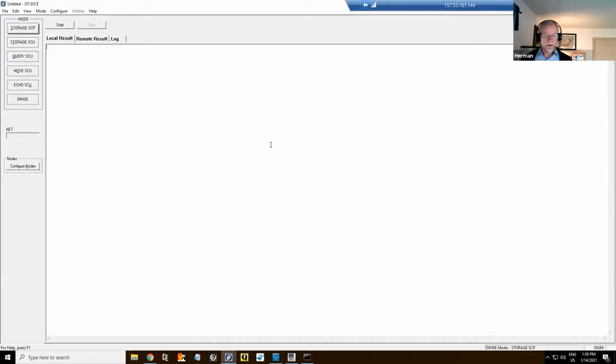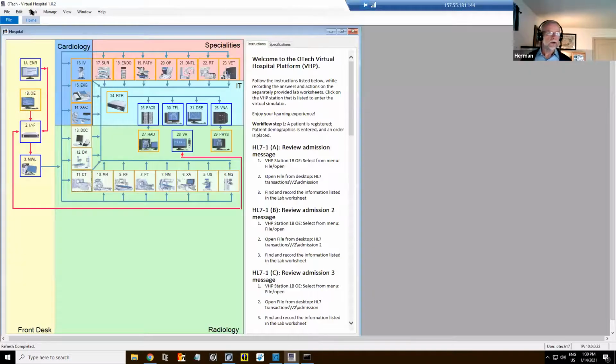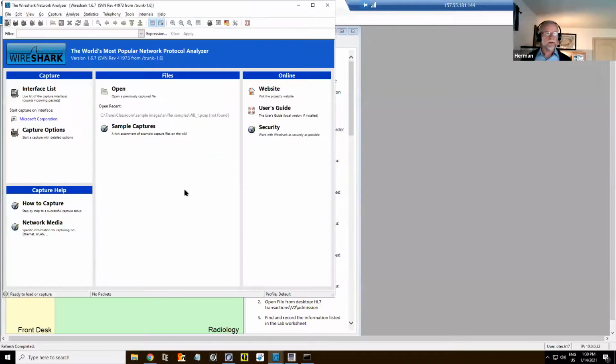Okay, so what we do next is start up the sniffer. The sniffer is here. I go to tools, and I have a lot of tools here. One of them is Wireshark. I have a little bit older version, because I don't know about you, but anytime there's a new version, I have to learn everything again. So I use 1.6.7 because I'm familiar and I know where everything is. By the way, in the meantime there's a new version as well, so when you download it, it might look a little different. I use 1.6.7 in this demo.